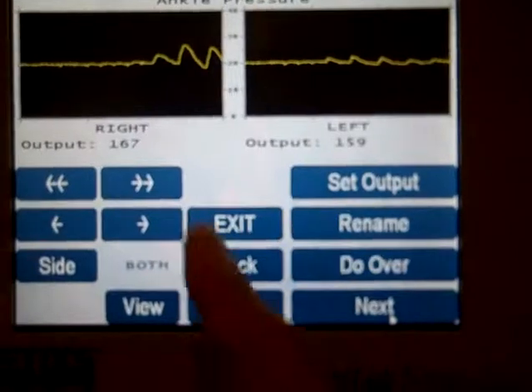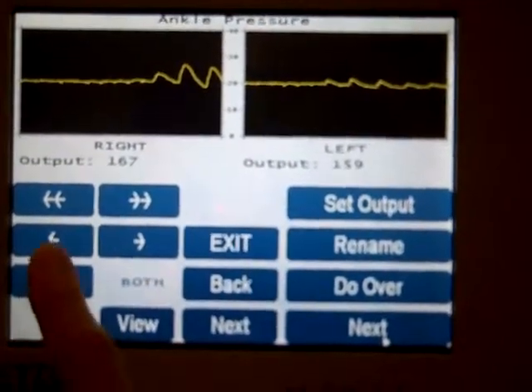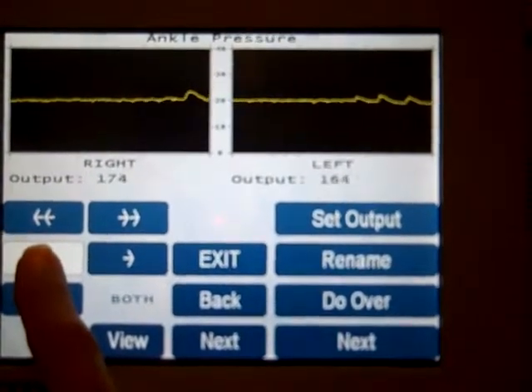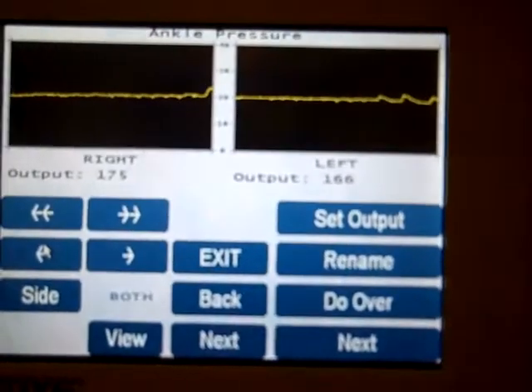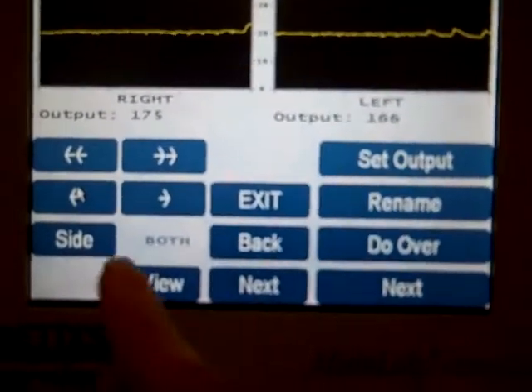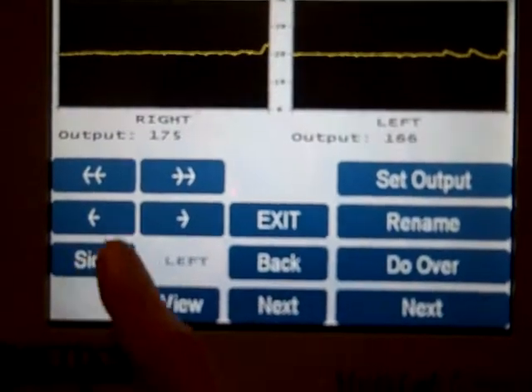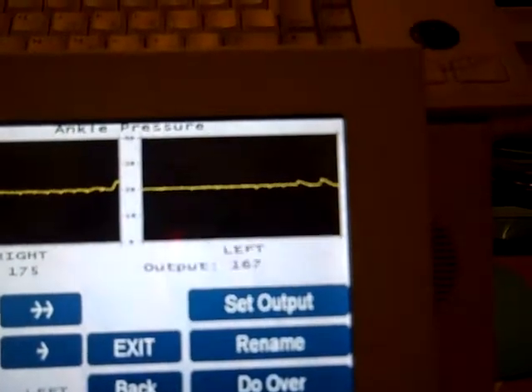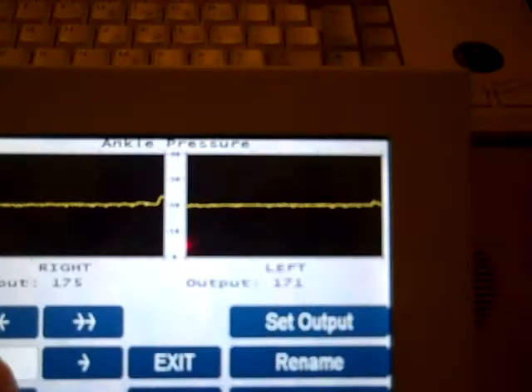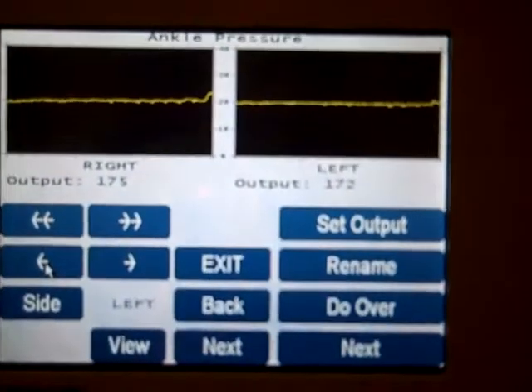Now I'm going to scroll both back to the first pulse using the scroll button — that one to there, and this one right to there. As you can see, that's the first pulse on the right side. However, I've got three beats more on the left side, so I'm going to change my side from right to left and scroll back to the first pulse, giving me a pressure of 172 and 175.